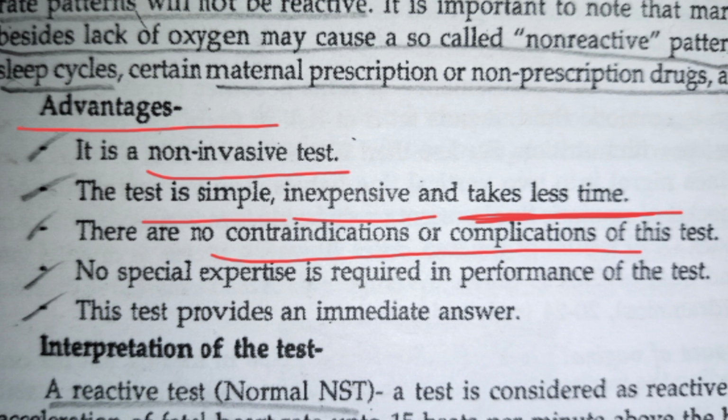And no specialist is required for performing this examination. If a person knows how to perform this examination, he is enough to perform it. And the report will be provided immediately. This is not a time-taking process. These are the advantages of NST.